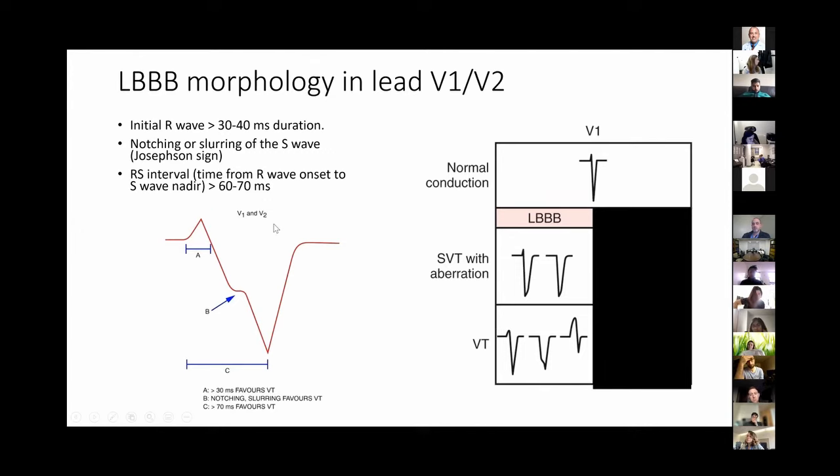And again, this is all based on the same principle: if there is really a ventricular rhythm, you will have this initial depolarization that is very inefficient and slurred.